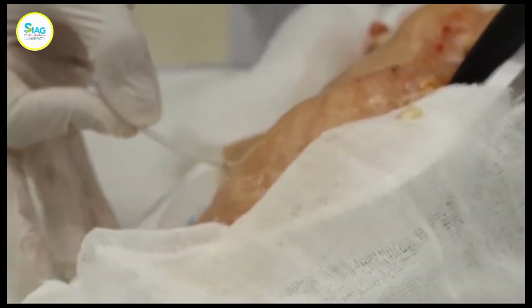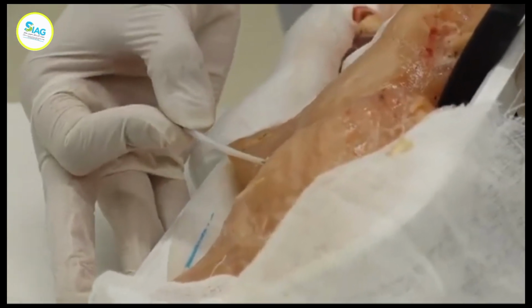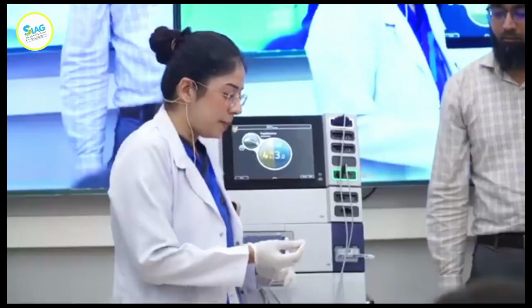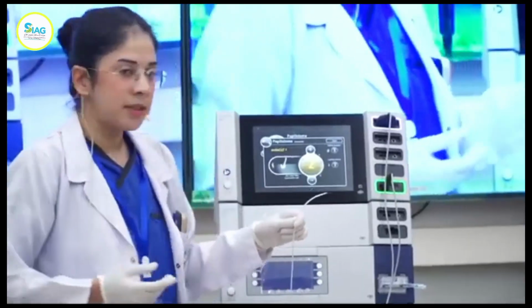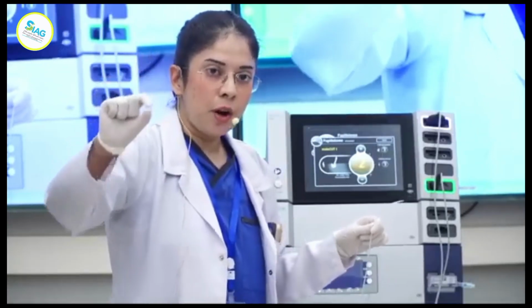Do you see there comes a bit of a pause? Now, I'm going to increase the effect to 4. I don't think you can hear, but I can. The sizzling is a little more. I'll tell you what it did. The pause is more intense. So what happens is, the difference between these 2 effects is basically how much coag I am introducing in between. And it's not that all of a sudden the current starts dancing in a different direction, it's coagulating. It's basically cooling down. There's an interval where the continuous cutting is paused. And that pause allows the temperature of that tissue to fall to a certain degree.